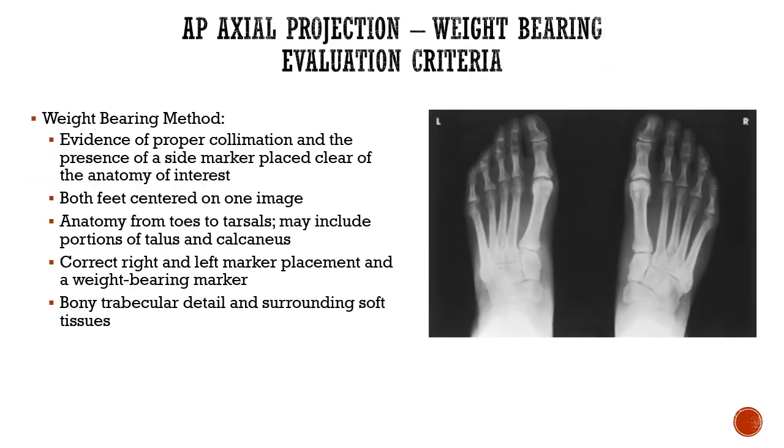So both feet should be centered on the image. We can have the anatomy from the toes to the tarsals and include portions of the talus and the calcaneus. We want to make sure we have the right and left markers placement and have a weight-bearing marker as well.